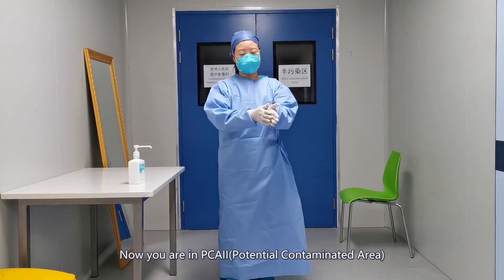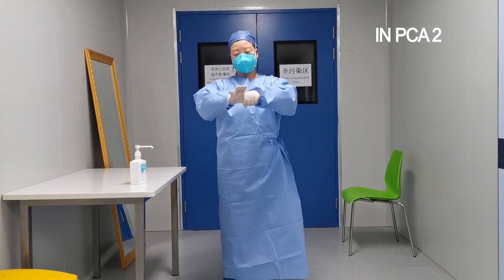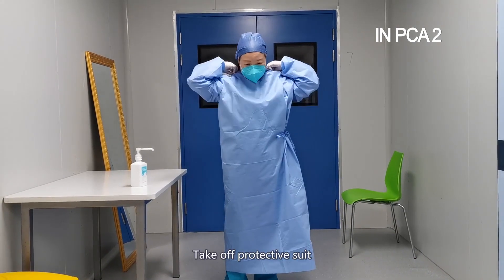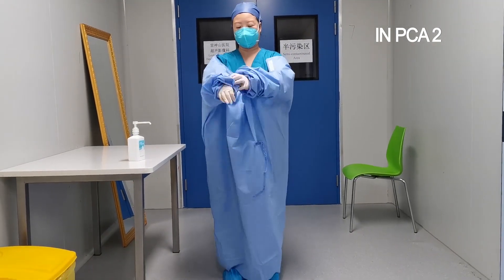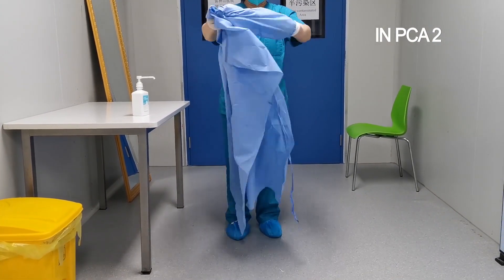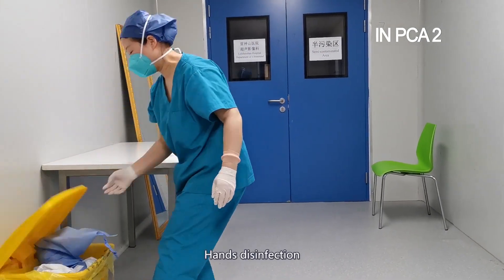Now you are in PCA2. Close the door and no stepping back. Hands disinfection. Take off the protective suit. Hands disinfection.